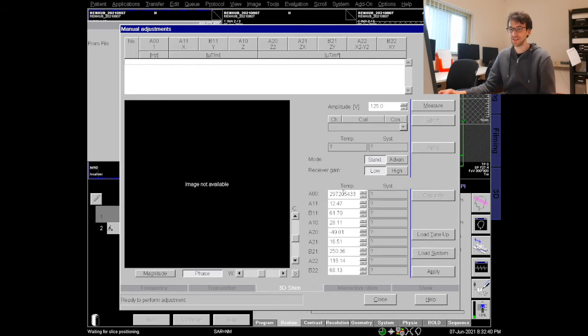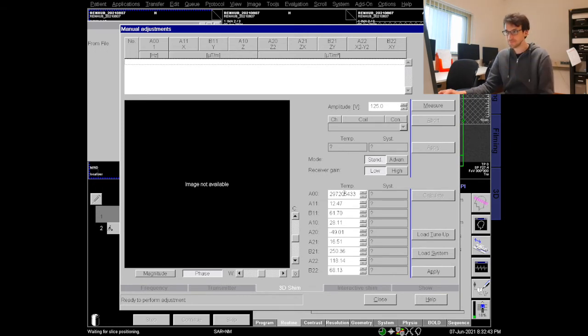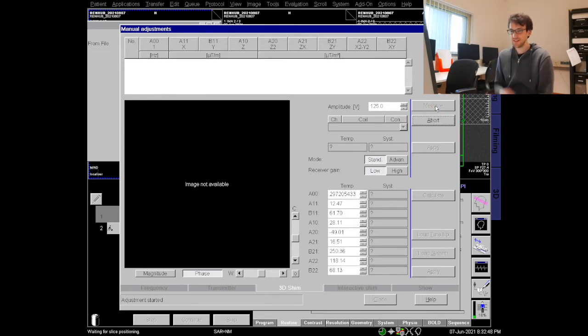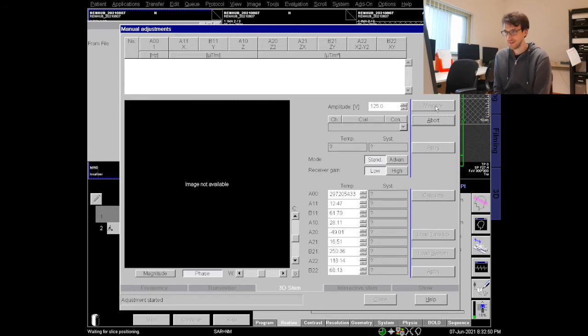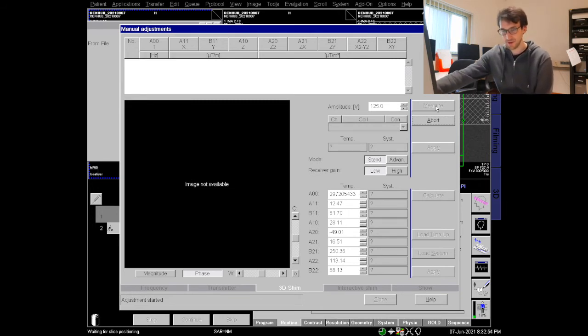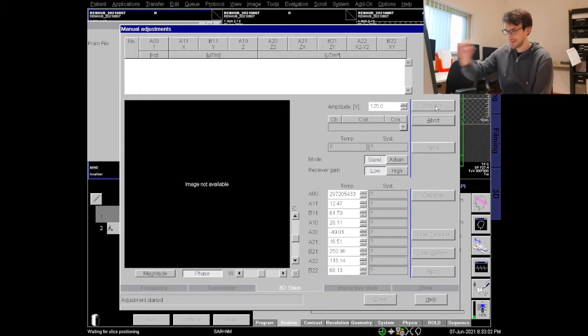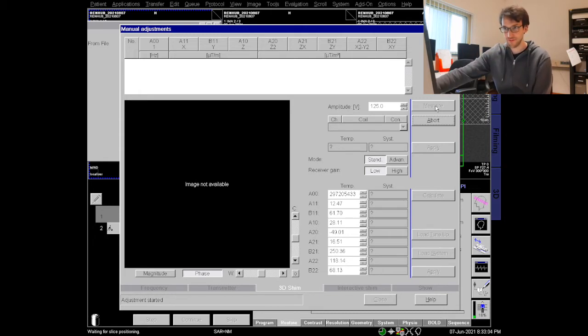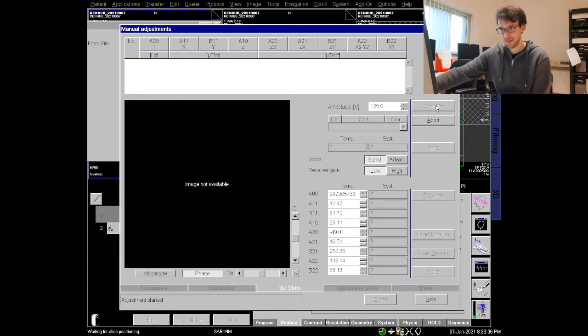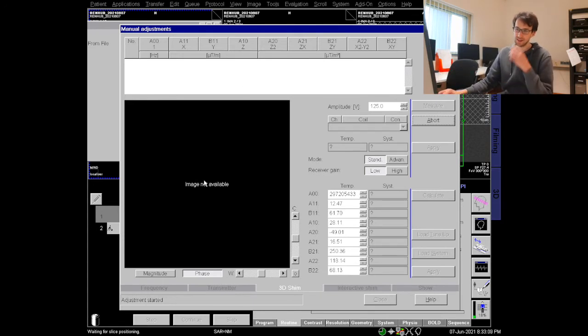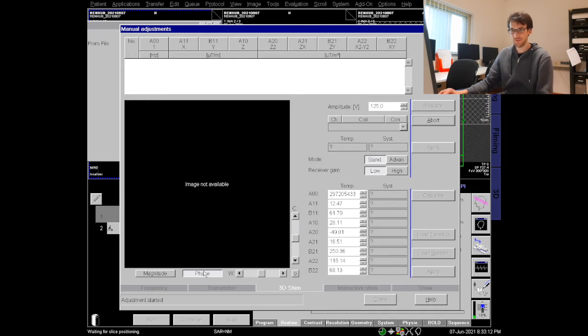In order to calculate them we first need to measure them. This takes a bit, it's a little gradient echo sequence and maybe you can hear it right over there. We are particularly interested then in the field maps or in the phases of this gradient echo sequence and it will show us the kind of phase maps in this little window here.